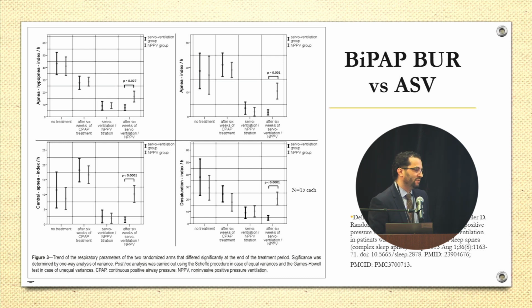The other thing for ASV is that there is a smaller risk of recurrence of central sleep apneas compared with BiPAP with backup rate. So ASV was better regarding the emergence of central sleep apneas than BiPAP with backup rate.